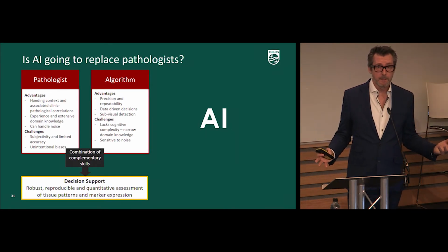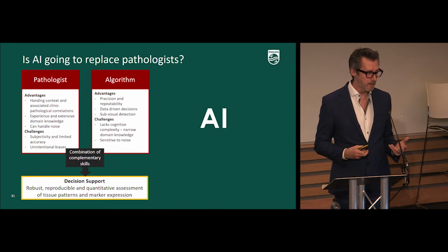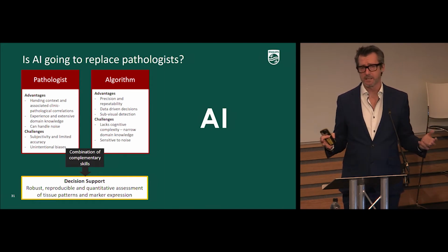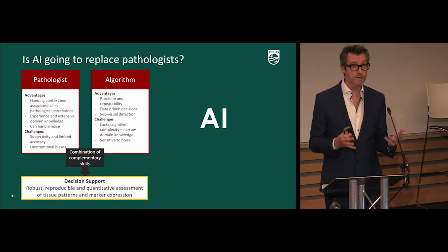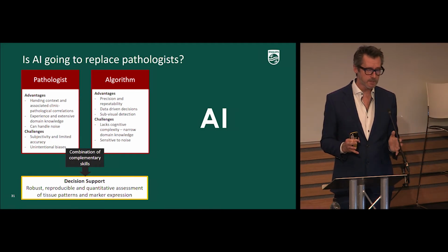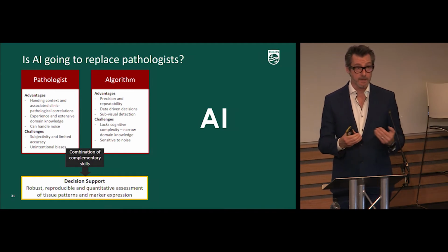As we begin to discuss these with diagnostic pathologists, there are a number of questions that inevitably come up. Pathologists are really worried that AI is going to replace them. We don't see this happening at all. I should rephrase that. I do see some applications where automation will absolutely be used routinely in diagnosis. But in most complex decision-making processes, we see a very close interaction between the pathologists and the AI algorithms that we're developing.